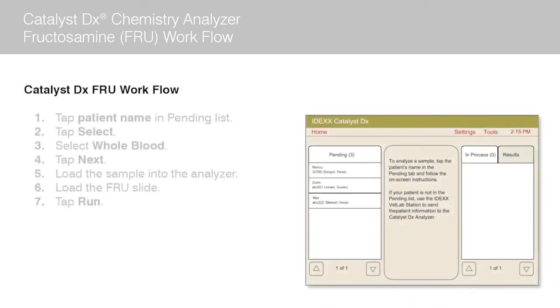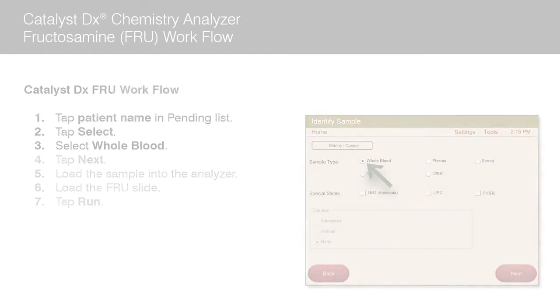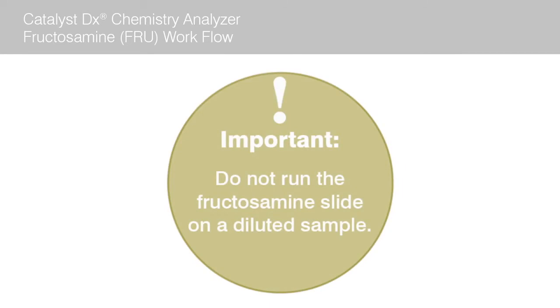Next, you will need to queue up your patient on the Catalyst DX analyzer. Once the patient's name appears in the pending list on the Catalyst DX home screen, tap the patient name and then tap select. Select whole blood as the sample type on the identify sample screen. Important: unlike other chemistry slides, it is not recommended to run a fructosamine slide on a diluted sample, as results can be compromised.